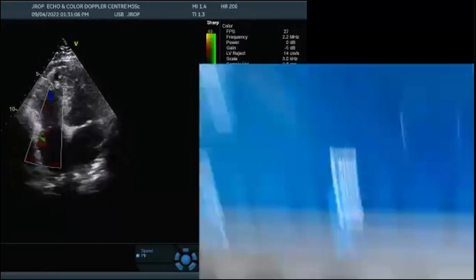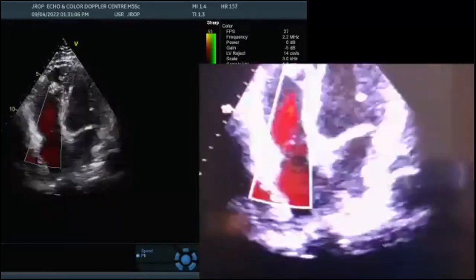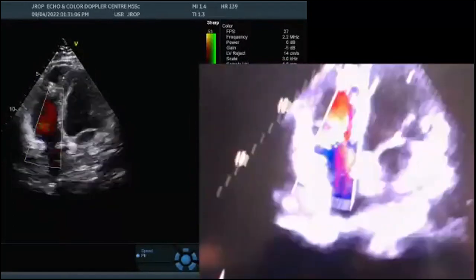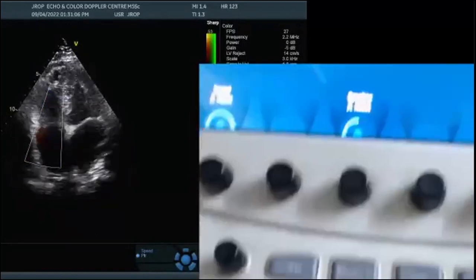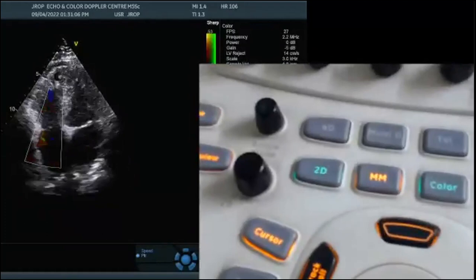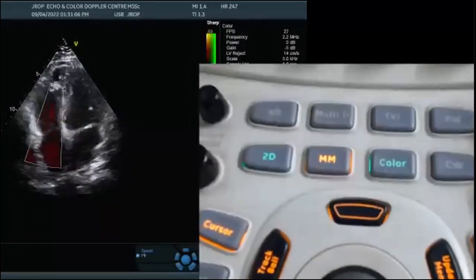Look, this is a screen which I'm projecting on the left hand side of your monitor, so I don't have to project on this machine monitor. Below the machine monitor, there is a touch screen, which I'm not going to use at all. But I'm going to tell you about various points on these machines. First point, you can see it very clearly.